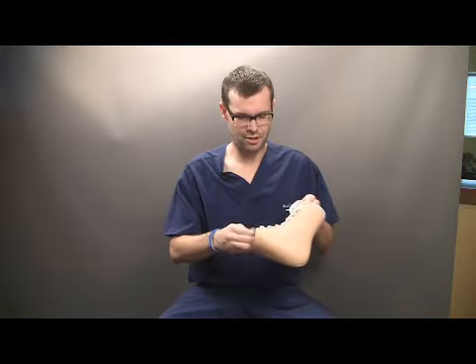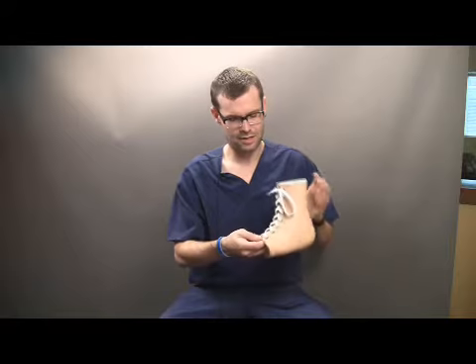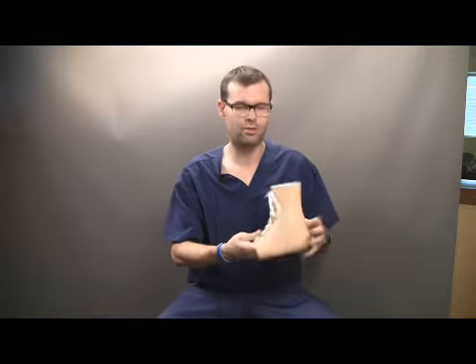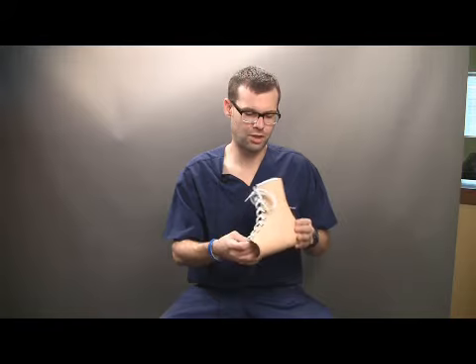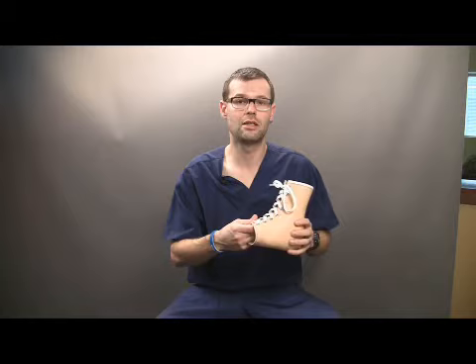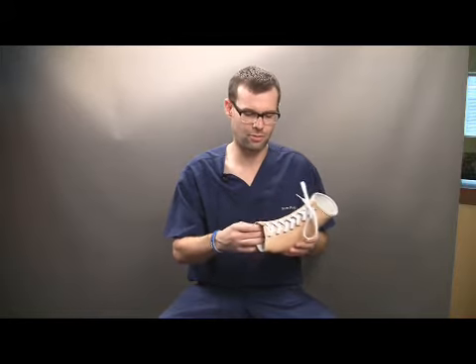One of the main differences between this Stepwell custom AFO and other gauntlet leather style AFOs on the market is the custom pre-tibial shell right here. The main reason for this custom pre-tibial shell is to limit the motion of the tibia over the talus and to disperse pressures over a greater area so as to not produce any skin breakdown. It does not exceed seven pounds per square inch, so no ulcers will be formed with the use of this device.